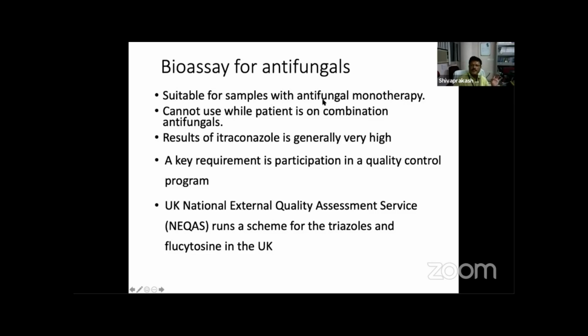So always, this is a very, very important thing. If the patient is on a combination of antifungal therapy, you know that if one antifungal is there in the serum, then it is inhibiting. So you can find out the inhibition of only that particular antifungal.